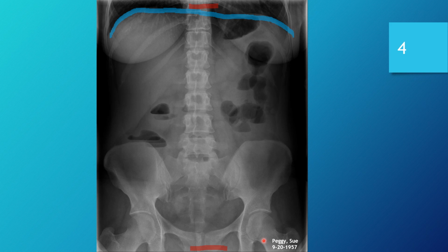With an upright abdomen, of course, we want to get as much as possible, but this one was exceptional because it does include the entire abdomen. On the lower portion of an upright abdomen, you absolutely must make sure that the tops of the crests are visible to have a diagnostic upright abdomen. Must at least include that much.